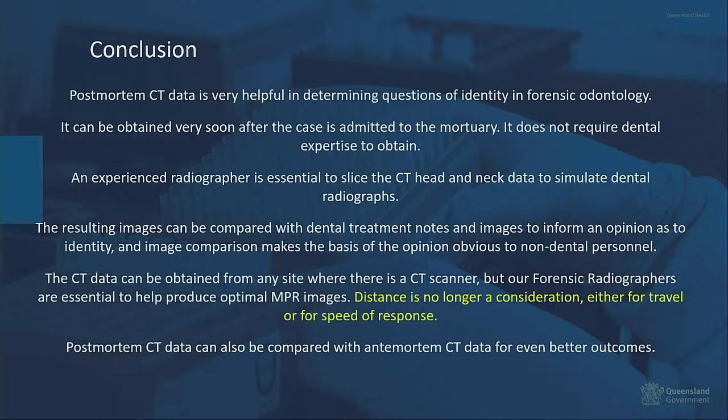The most important thing, though, is this. That CT data can come from anywhere in the country where there is a CT. We no longer have to travel large distances to do identifications, and that means we no longer deprive Brisbane of a treatment facility when we leave. So if you are dealing with something like Indonesia, where you have an absolutely massive archipelago with huge distances, something like this may make your work very, very much easier.